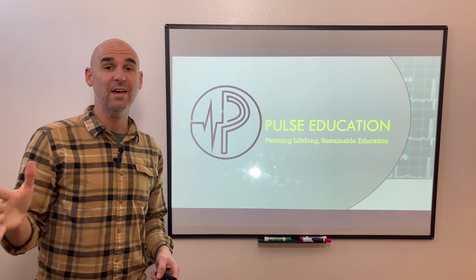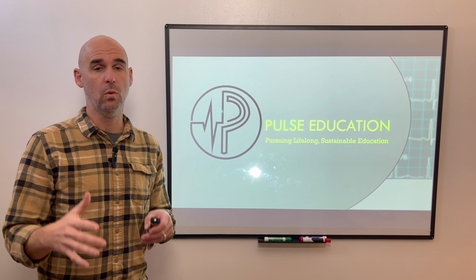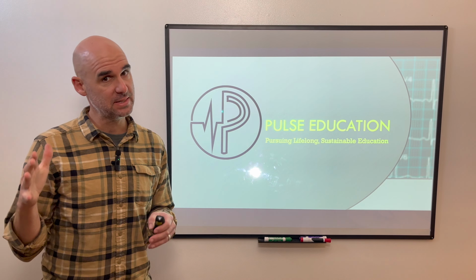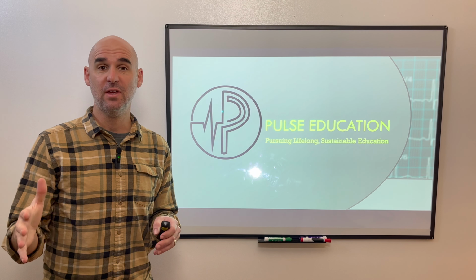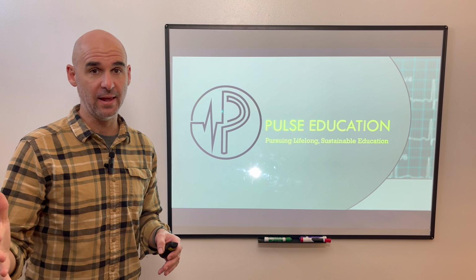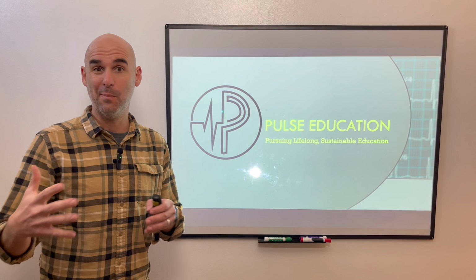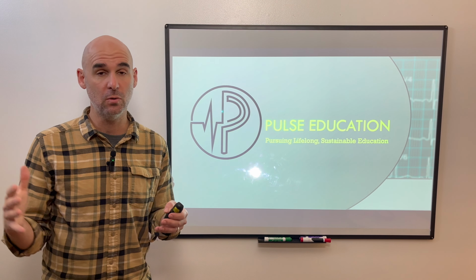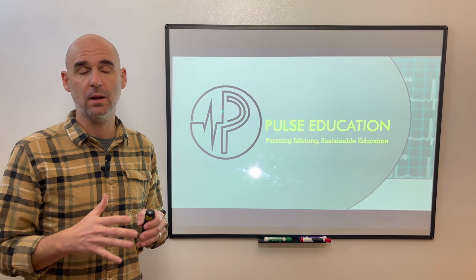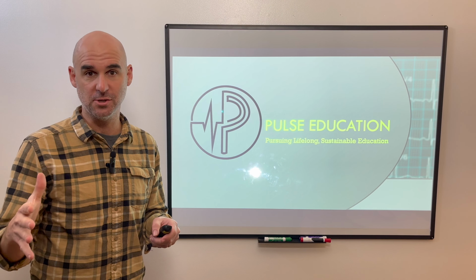So there are plenty of people out there who either don't understand axis deviation, or it's confusing to them, or they don't see the value in it. But I'm here to tell you today that axis deviation is super important, and that with a little bit of practice, you can get good at it. And then it can actually give you a wealth of information about your patient, about their cardiac condition. And I can tell you in my career, knowing axis deviation has helped me out a tremendous amount of times to make sure I'm doing the right diagnosis for my patient.